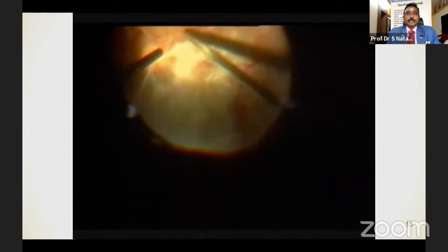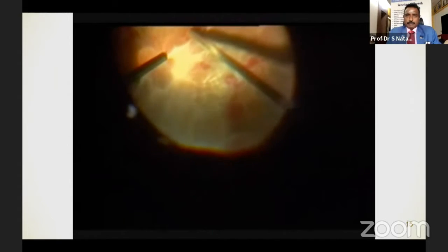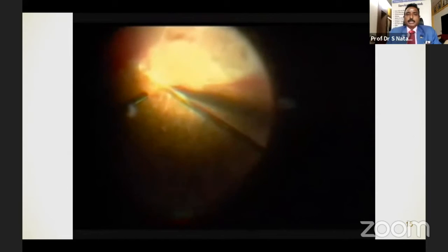The idea is, this is what is a proportional mode, where you can push the fluid between the retina and the fibrous tissue. It takes a little longer, but the only thing is you don't have to exchange instruments. You can also do a bimanual surgery. Again, I don't go with the idea of doing only this technique. I do it depending on the eye.